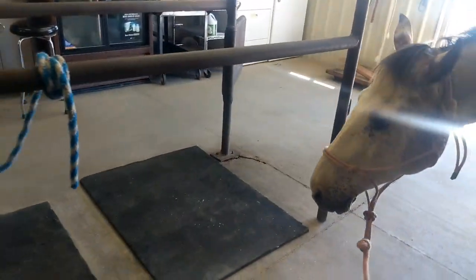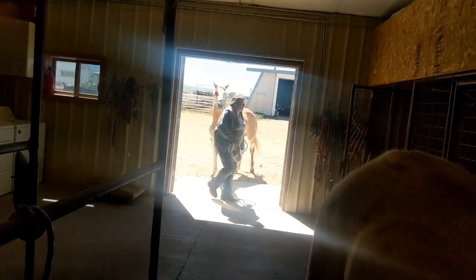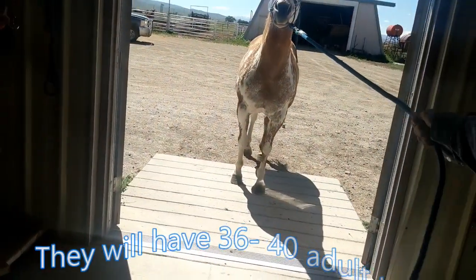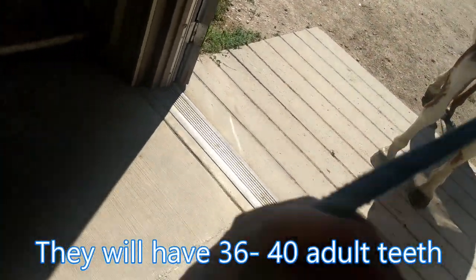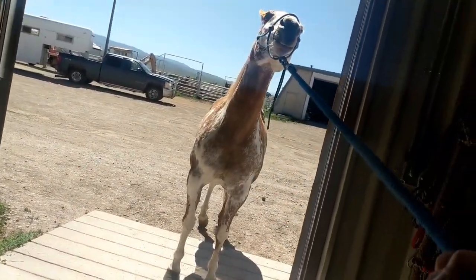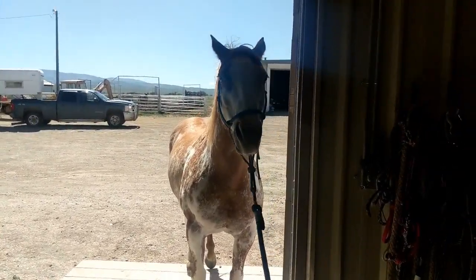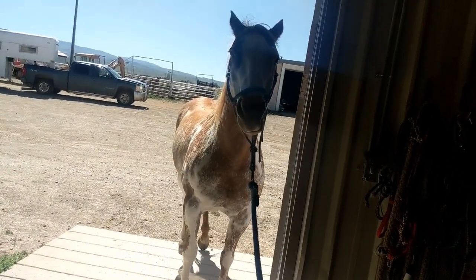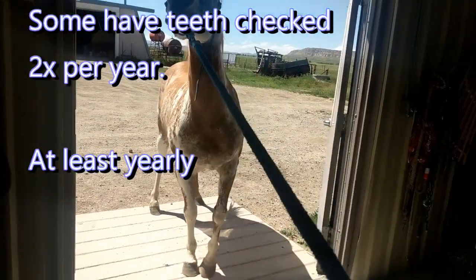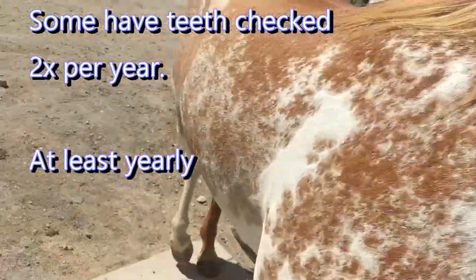Come on, there we go girl, come on Sparkle. It's that transition from light to dark that's so hard. Come on, there we go — good girl. Think about it a little more.